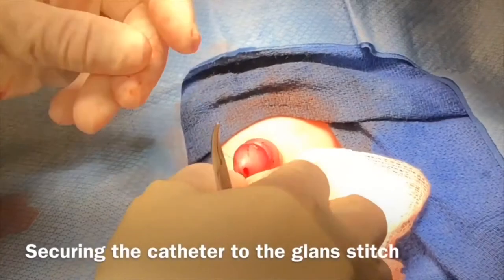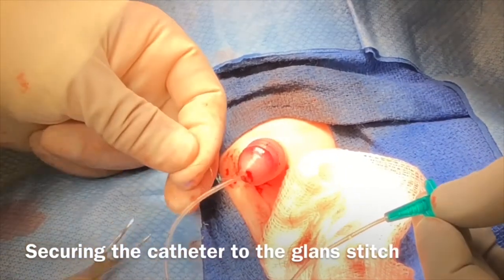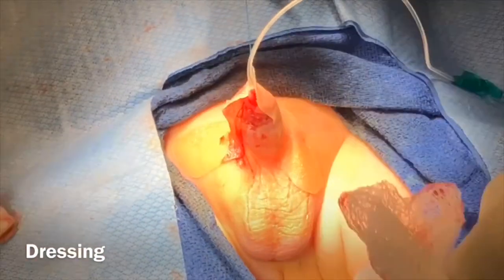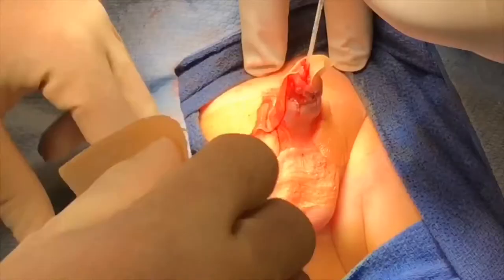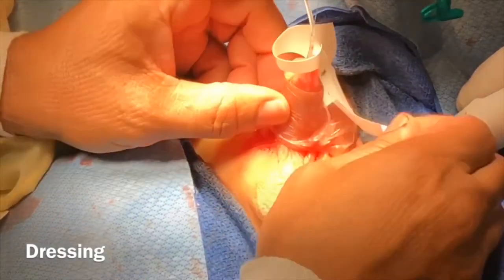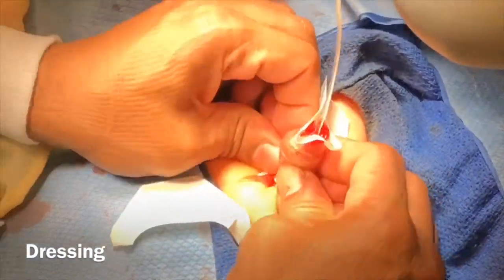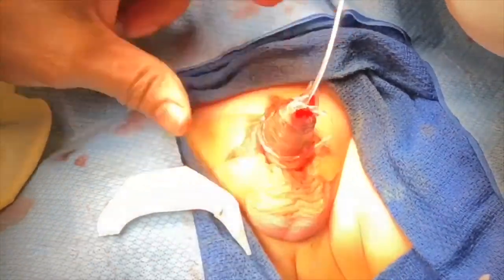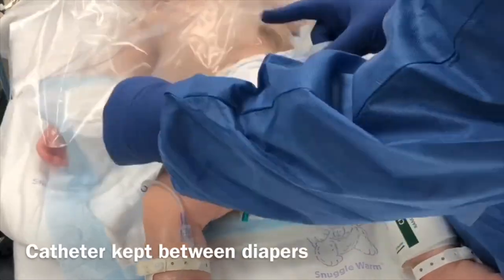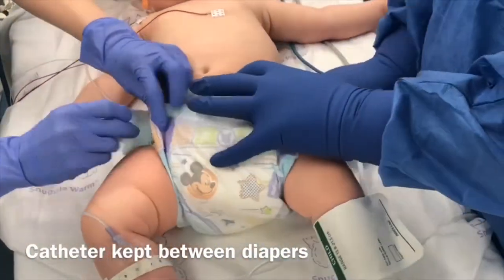It is very important to apply the dressing in an appropriate compressive fashion. The 5-French feeding tube is secured to the glans suture, and a compression DuoDerm dressing is applied for hemostasis, reinforced by Tegaderm. The catheter and the dressing will be left for five to seven days, with the catheter in the form of feeding tube draining into a double diaper.